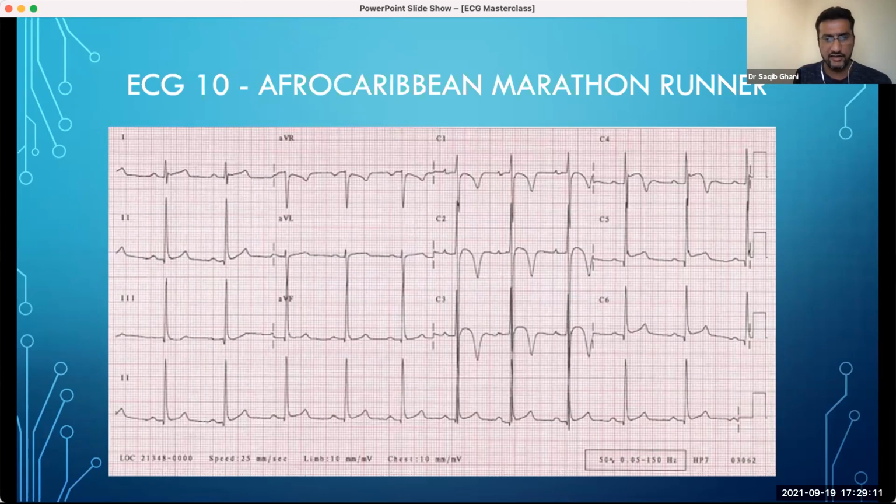Because of athletic activity, the genetics, the cardiac remodeling, they sometimes throw off very abnormal ECGs. And that's why an expert needs to be interpreting these ECGs. I would definitely say this patient needs a referral to cardiology though. You can't just look at the ECG and say, yeah, it looks fine, you might just be an athlete. You have to rule out heart abnormality. They need echo, they need MRI. And after that, you can say it's fine. We couldn't find anything, it's just because you run a lot.